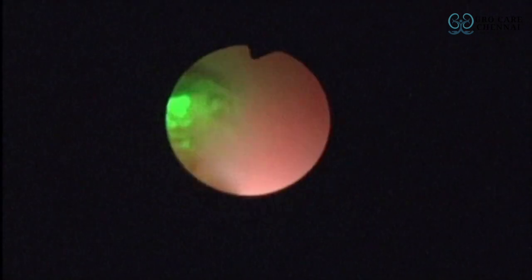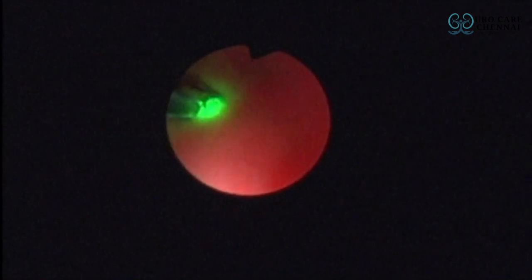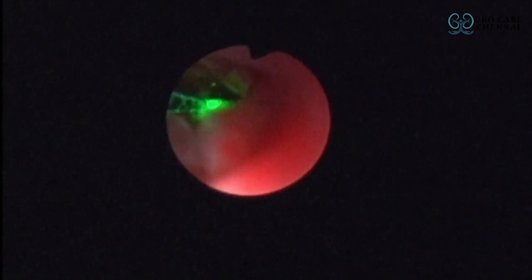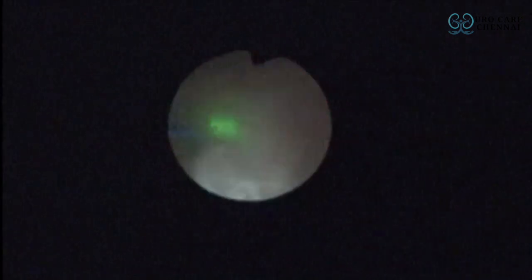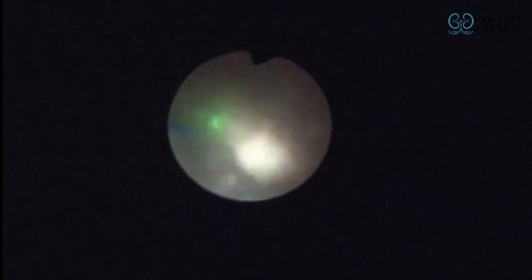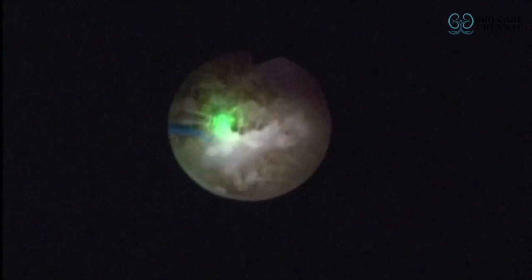Once the site of stone was confirmed, the opening was enlarged with the help of laser and the stone was localized. Then the procedure was quite simple. The stone was fragmented into small pieces and removed. We can see here the stone is being popcorned into small tiny fragments resulting in golden dust, and the stones were flushed out of the diverticular opening.